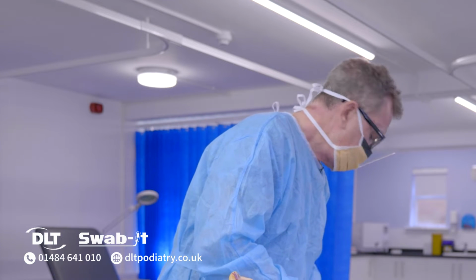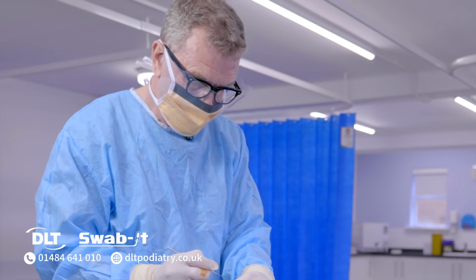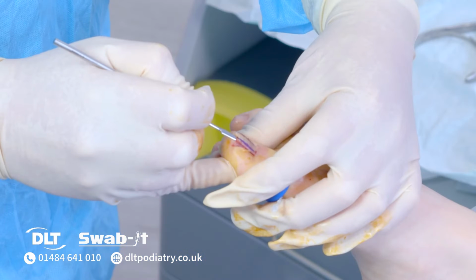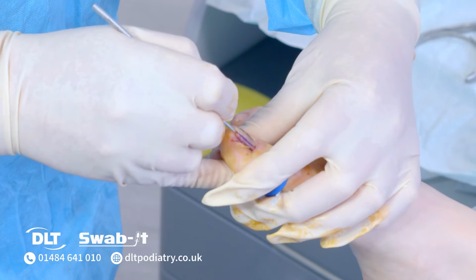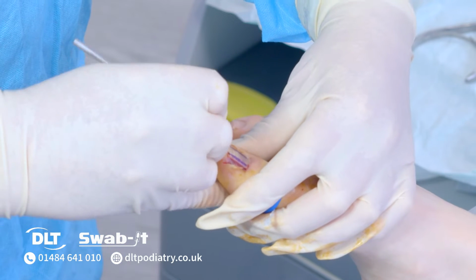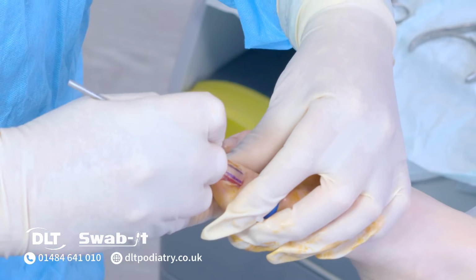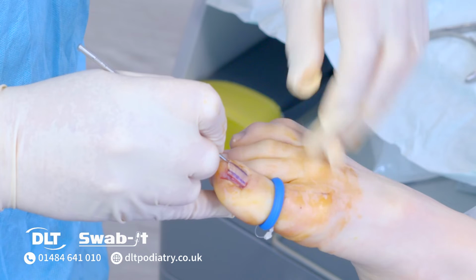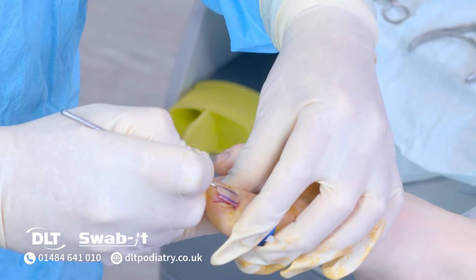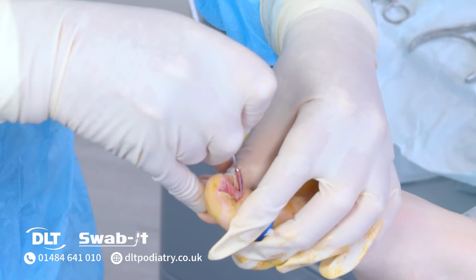So now we're going to progress and do the full total nail avulsion. Again, position the toe so it's comfortable for you and the patient. If you move the elevator horizontally across, it means that you're handling the tissues very gently because you're not at risk of breaching the nail bed. So I move the elevator across, then I lift once I'm under the eponychium.